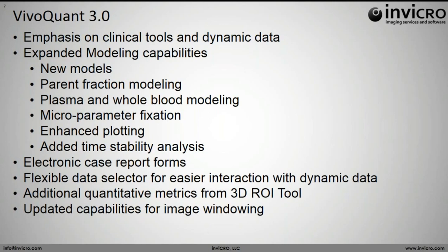And finally, one that's very interesting and exciting is we've updated our capabilities for image windowing in terms of how we interact with the color palettes and viewing the image window. So we're very excited about that.